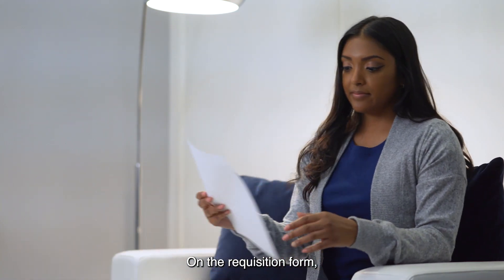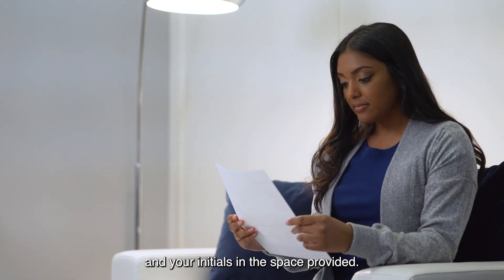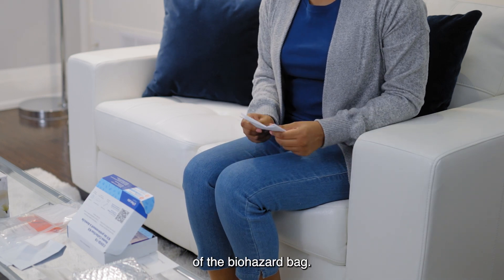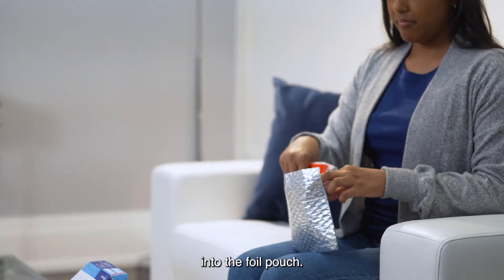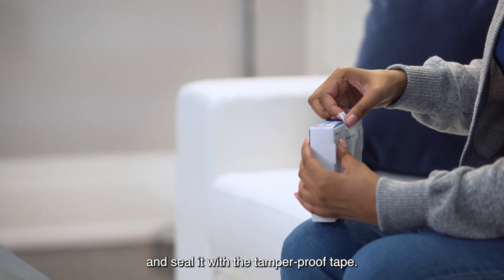Place the tube in a biohazard bag along with an absorbent strip and seal the bag. On the requisition form, fill in the date and time of collection and your initials in the space provided. Fold your requisition and place it in the outer pocket of the biohazard bag. Then place the biohazard bag into the foil pouch.